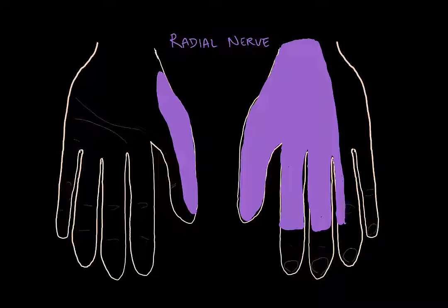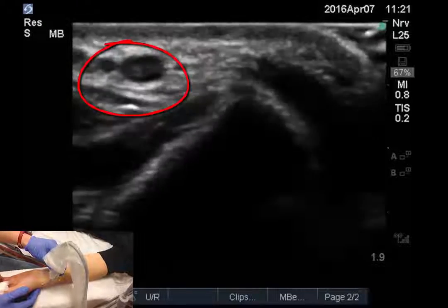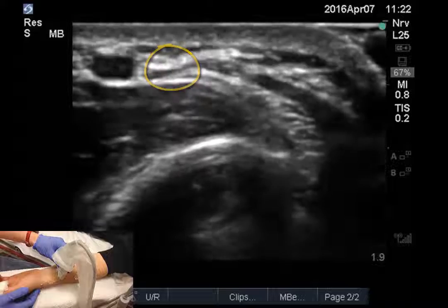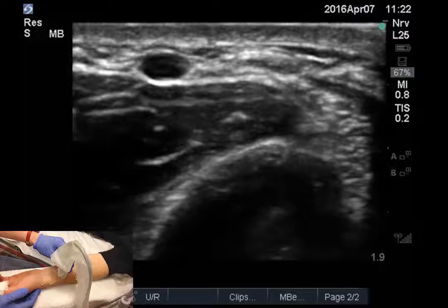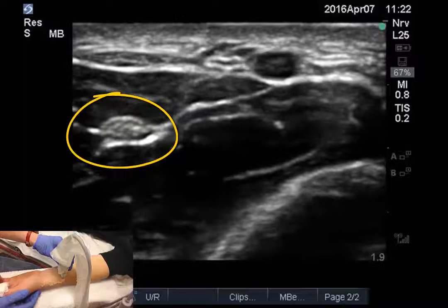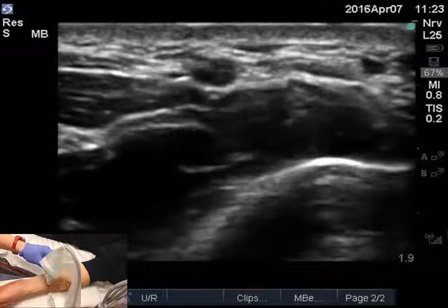We will start with the radial nerve. Ensure that the probe marker is pointing radially. Identify the radial artery at the level of the wrist and trace it proximally until the mid forearm. The radial nerve will be radial to the radial artery. Slide the probe in the ulnar direction to identify the median nerve, then slide back. Now slide the probe a bit to the ulnar side of the forearm to place the radial nerve at the edge of the screen.